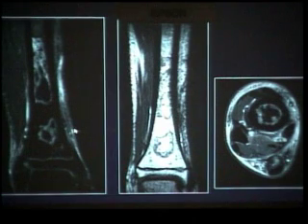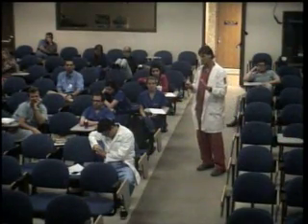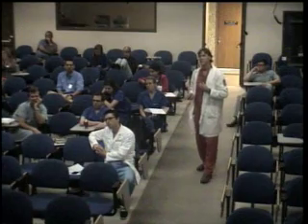The line is the sclerosis. So that's got to be the inside, and then the other line is edema and dying bone, so that's external. No? All the way around. So it's the sclerosis on the outside. Correct. The outer line is the hypointense, because the bone is reacting with sclerosis. And the inner line is the hyperintense, that is due to edema and granulation tissue. Very good.